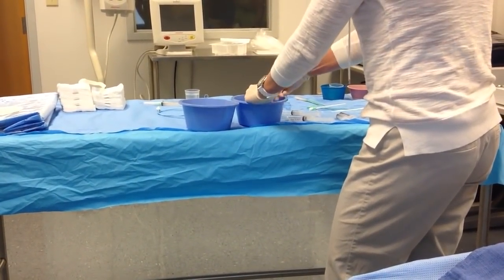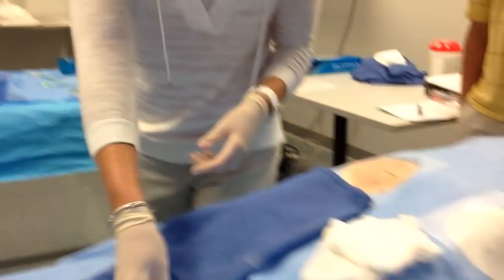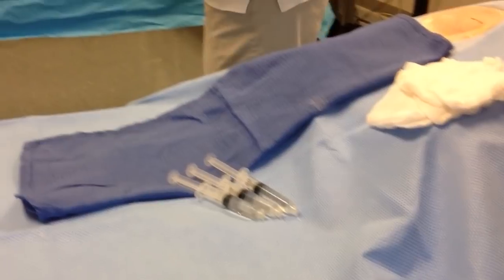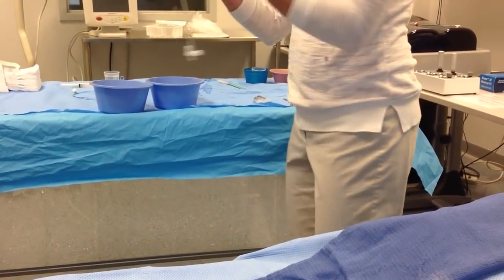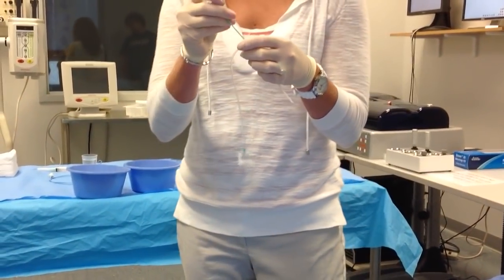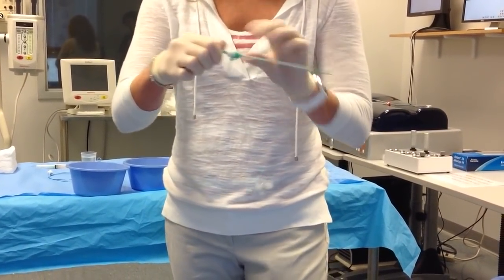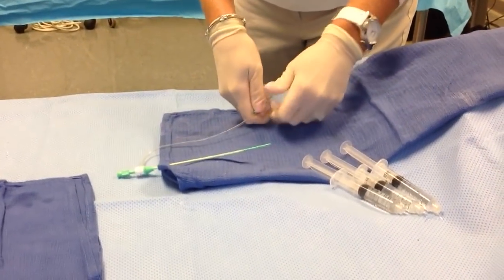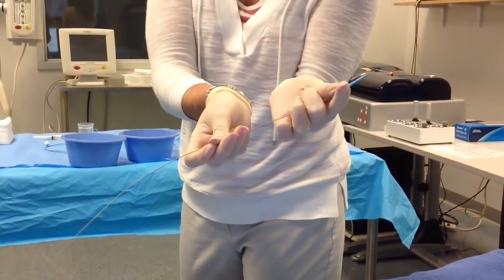So I'm just getting some heparinized flush in my syringes here. So we bring some of those over so the physician has some to flush the sheath in. We flush the sheath and the dilator. So I'm going to put the dilator in the sheath. And then we're going to lay that there. We'll bring our short guide wire over. And you want to straighten that tip out.